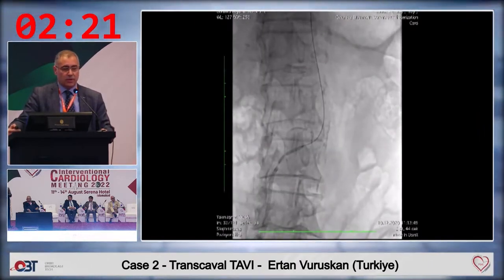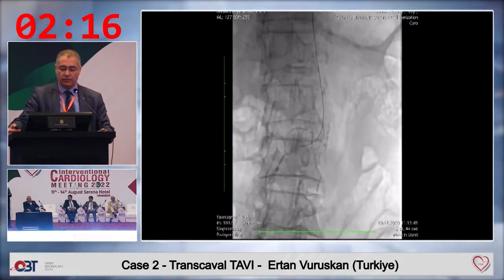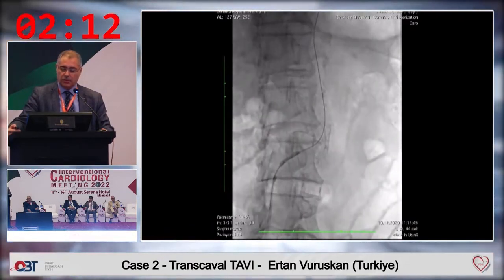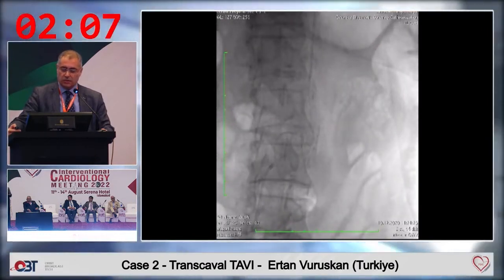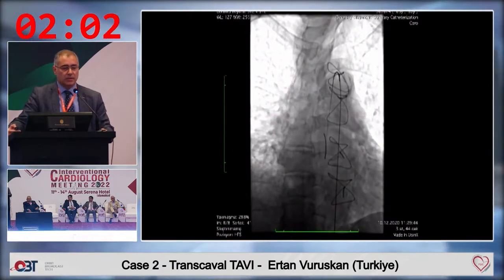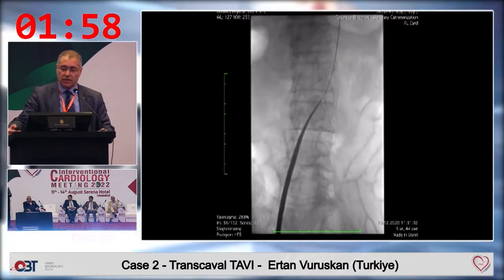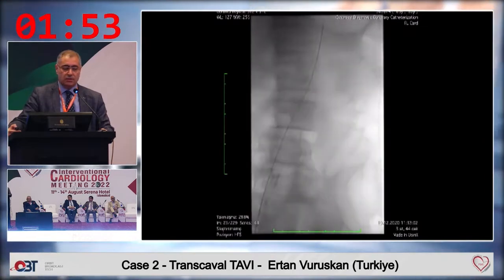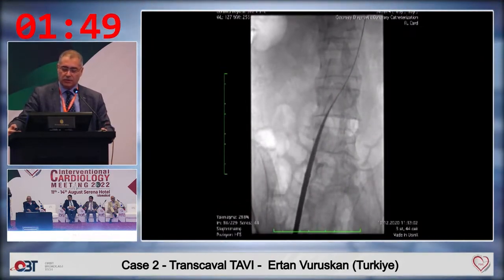We couldn't advance Fine Cross catheter, so we did balloon dilations, 2.5 balloon catheters. As you see, it's very hard and ruptured. Afterwards, we advanced Fine Cross, NaviCross catheters. For the sake of time, I am being quick. And we placed a backup Meier guide wire. We first dilated with the dilator. Afterwards, we advanced the long sheath. The length of the sheath is very important.